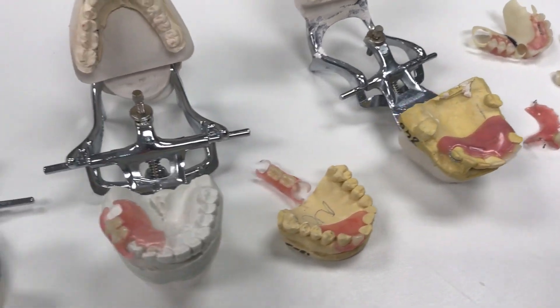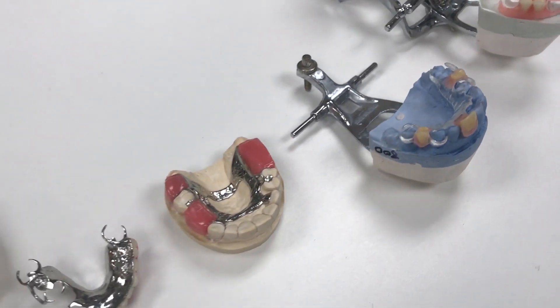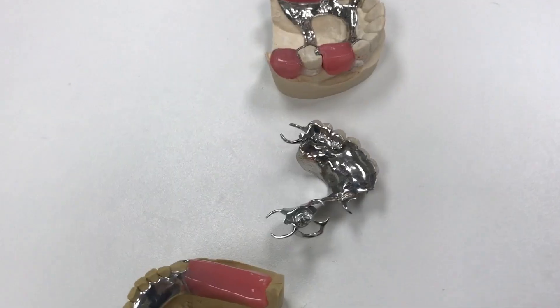Today at LSK, we're going to discuss partials and the differences between each type and what they're used for.